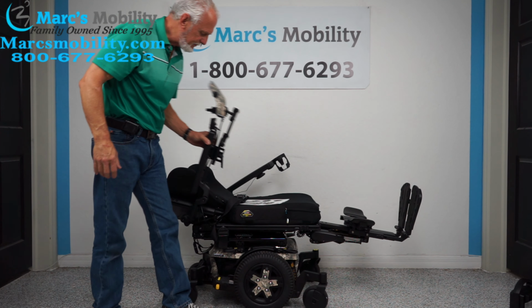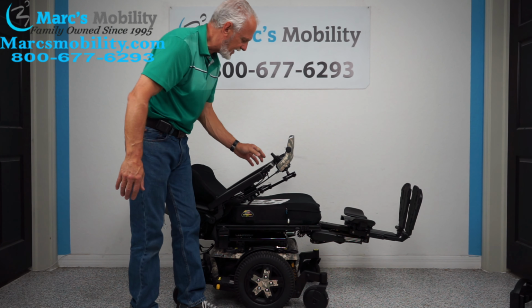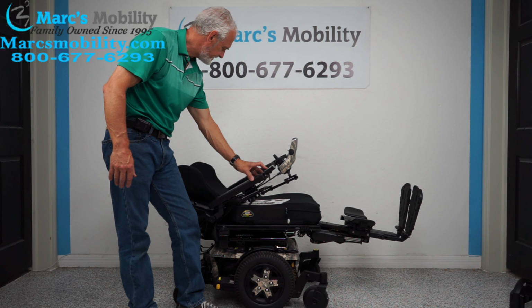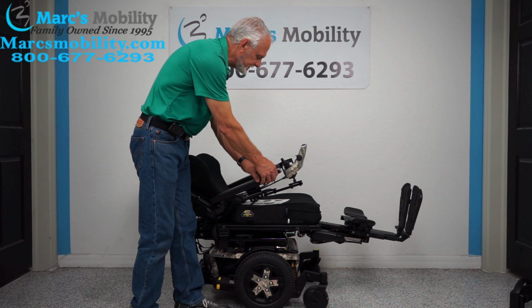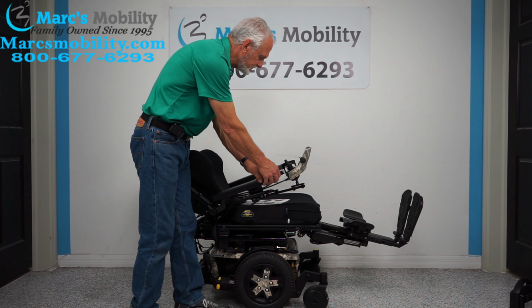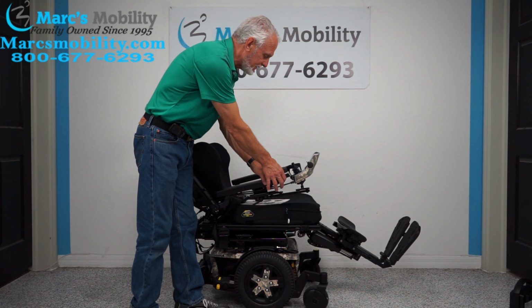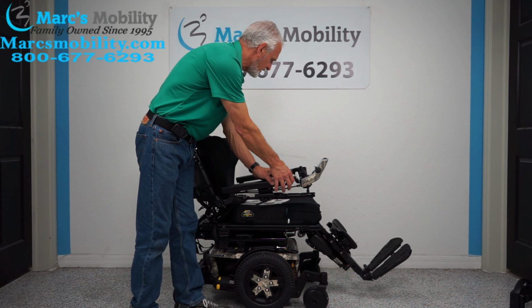As you can see, both arms can flip up, which is nice. If you transfer from the side, you need these arms out of the way. So we're going to bring the back up. We're going to bring the legs back down. I'm going to do 2 buttons at once here. These buttons do take a second to respond, so if you hit a button, just don't hold it down, it'll start moving. You got to give it a second.